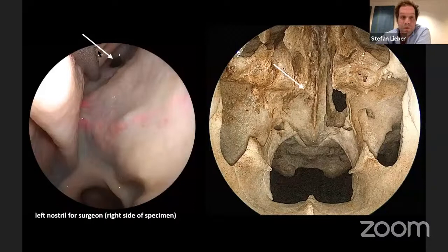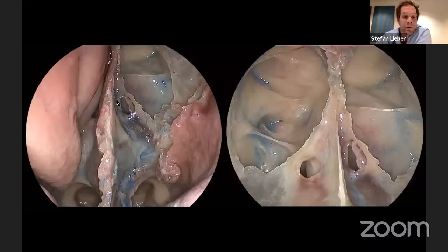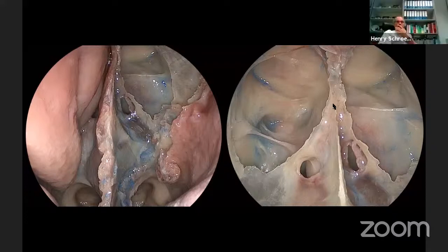And then hidden here, usually hidden under the superior turbinate, equal here, windowed on the other side, sits the sphenoidal ostium. This again is a stepwise exposure with the ostia here, peeling of the mucosa on the left side, stepwise exposure of this anatomy. You can already appreciate some of the key landmarks, the genu of the carotid artery here and the orbital apex and the optic nerve. This is planum sphenoidale and the rostrum in the midline.